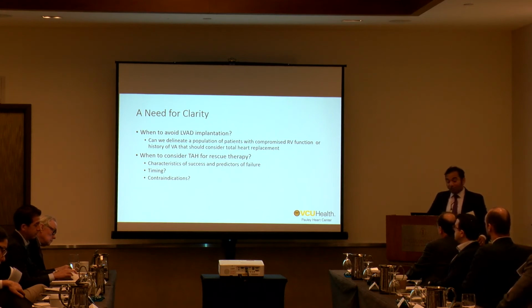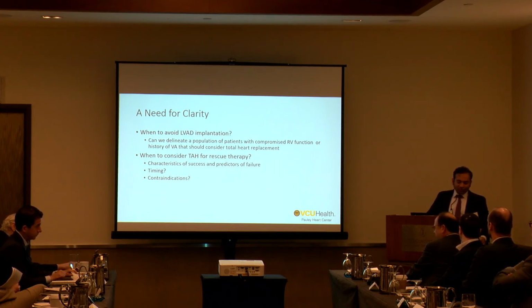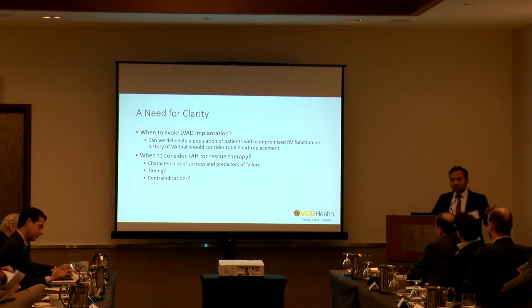What I think would be helpful is if we collated some of our data, everyone's experience about salvaging LVAD patients, and also better understand upfront what clinical characteristics patients have when we're considering an LVAD that may portend them to having a more catastrophic failure. Maybe not so much our lighter definitions of RV dysfunction or ventricular arrhythmias afterwards, but enough that leads to us considering or regretting having put the LVAD in.